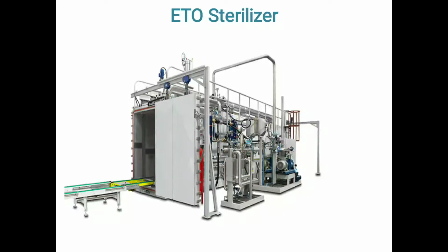An effective ETO process can be properly designed for almost every type of medical device and permeable packaging configuration, provided that all variables are assessed through process design and development. Typically, the ethylene oxide process can be broken down into 4 basic phases. These are air removal, then steam injection, and then ethylene oxide injection and gas purge.